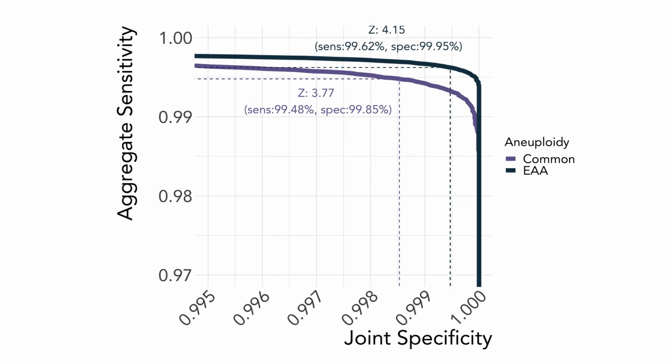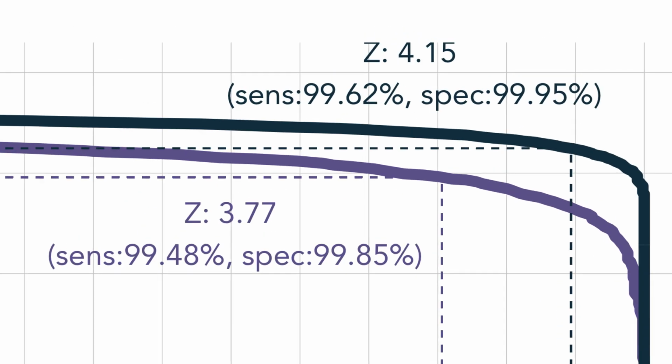Incorporating the prevalence, degree of mosaicism, and fetal fraction, we established the analytical aggregate sensitivity of 99.62% and the overall specificity of 99.95% for the additional aneuploidies. This characterization has important implications for interpretation of NIPS results. We show that mosaicism is common, not an edge case, when performing expanded aneuploidy analysis, and this must be taken into account when reporting positives. Therefore, characterization of the prevalence and the degree of mosaicism for these less common aneuploidies on our platform can provide additional value in clinical practice.